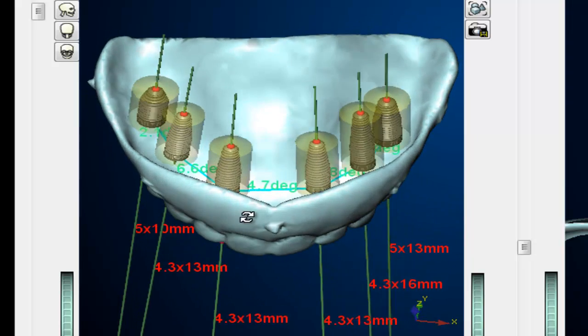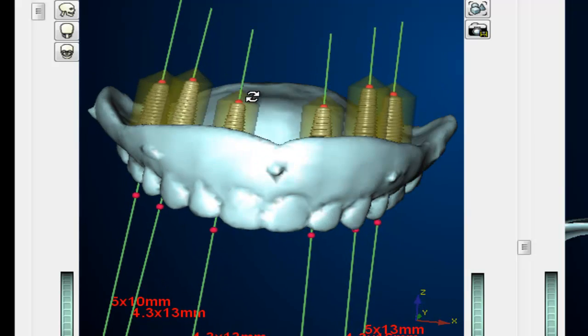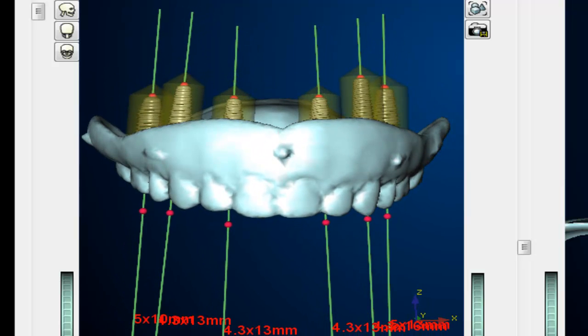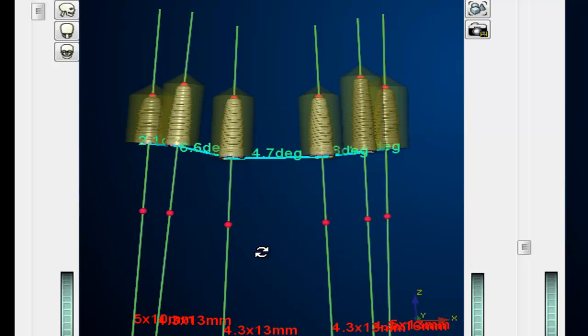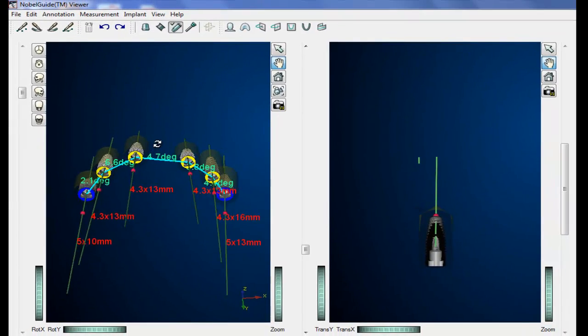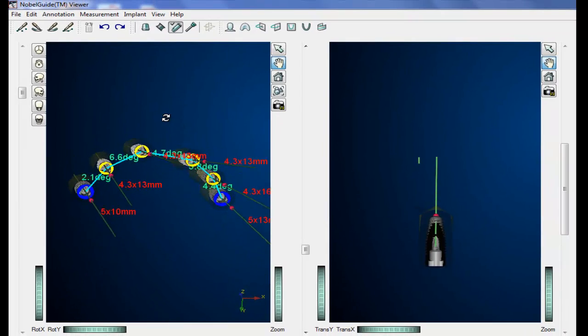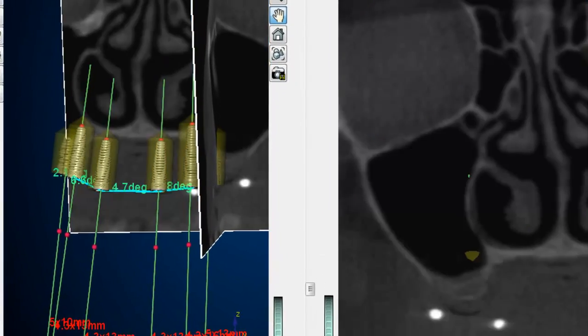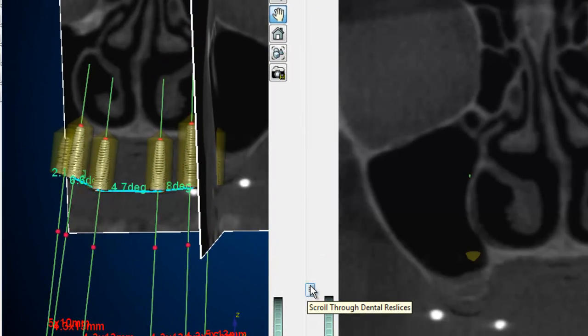Once the registration process was complete, ImageDent prepares the case for the next step by placing the implants in the approximate areas that were requested by the surgeon. During a hosted online web meeting, the surgeon, restorative dentist, and laboratory technician simultaneously provided feedback to the virtual treatment plan coordinator to perfect and finalize their treatment plan.